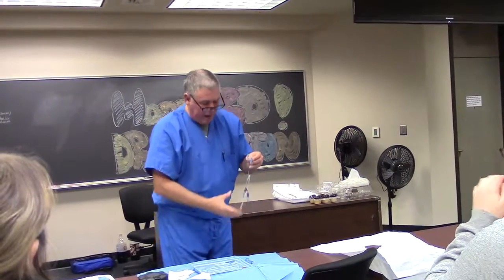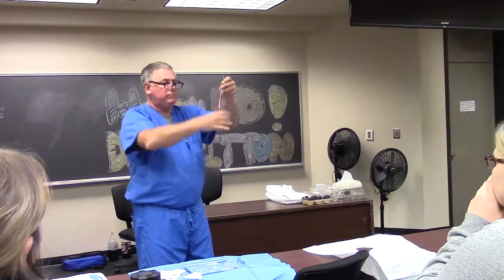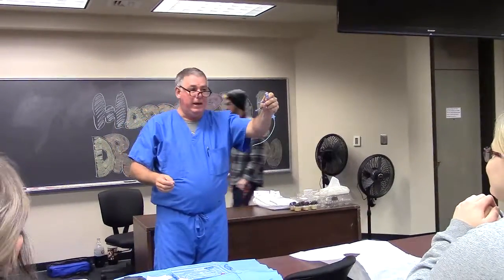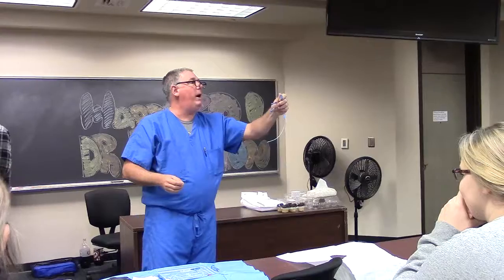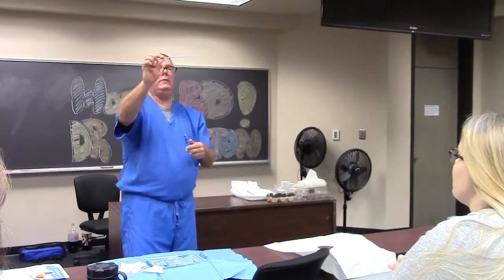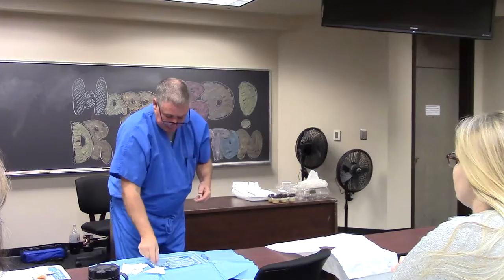This is the triple lumen catheter right here. You want to have these three ports charged with saline before you get underway here, okay? So, you know, there you go. All right. And finally, this is the dilator here that you're going to use. There's a scalpel here that you'll also use. It was a number 11 blade. It's that sharp pointed one.